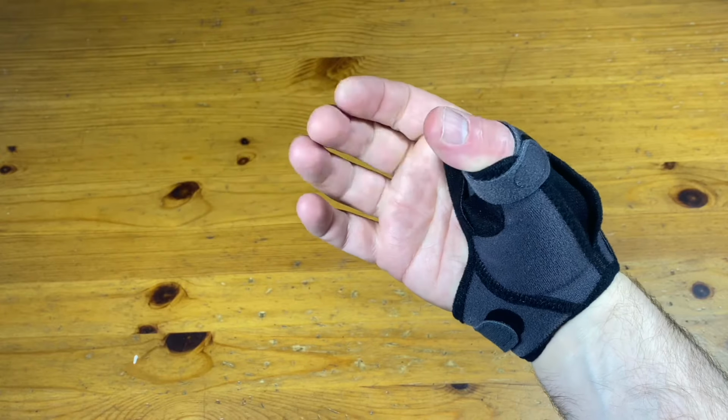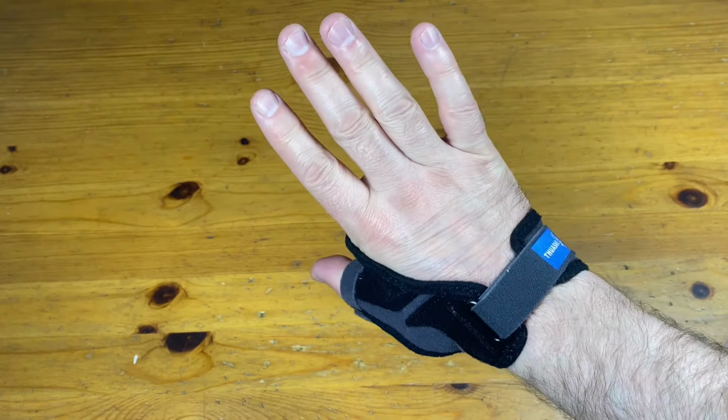This particular one comes in two sizes, size 1 for wrists of 13 to 17 centimeters circumference and a size 2 for wrists between 17 and 23 centimeters. This one is a size 2. They retail for about £25 or about $30. And you can still move your thumb tip to fingertip fairly reasonably with this one, but it is more restricted than the last because it does provide that bit more support.